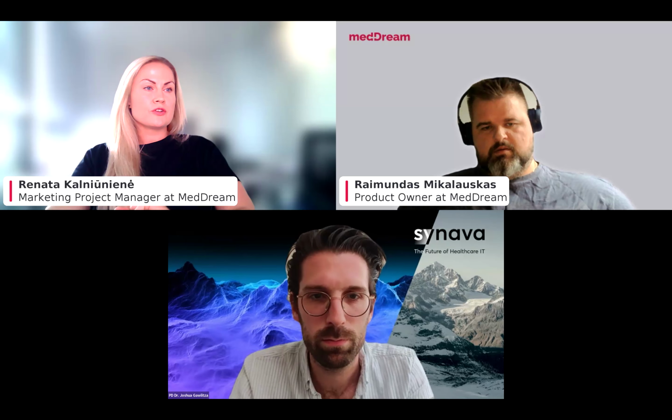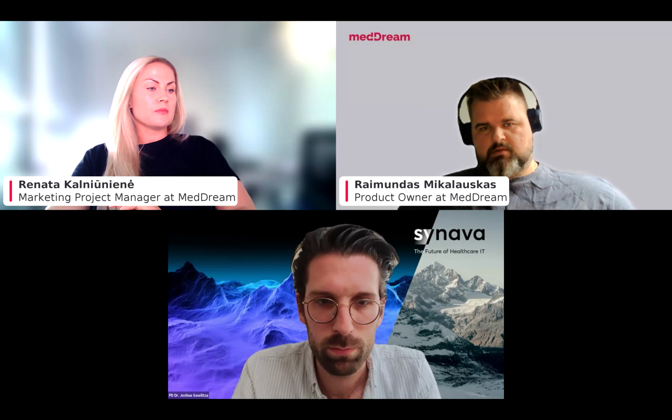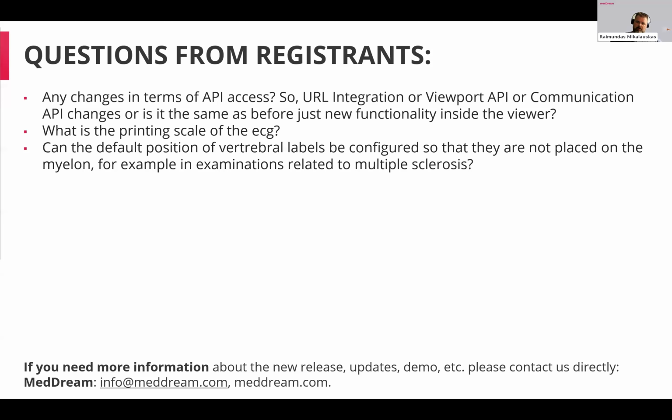Okay, thank you for the explanation, Joshua. If we are not having more questions, I'm going back to showing my screen then. While Renata is sharing, in a month we are planning to have translations for the user manual and UI for German, French, Italian, and Spanish languages, and then we will release 8.9.1 with only the translations.